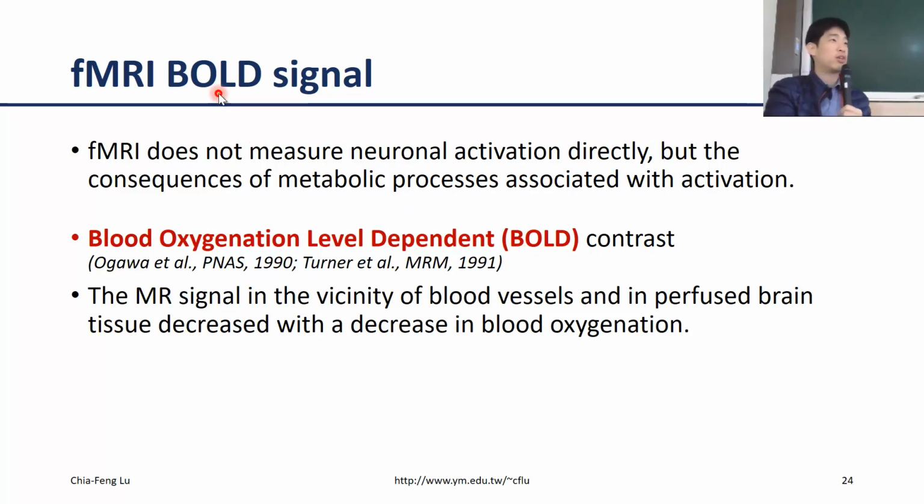But actually there is another technique we call ASL fMRI. But I think that is a relatively small number of studies using this because the SNR is pretty low in ASL and there are several limitations in ASL anyway. So in this semester we focus on BOLD fMRI, not ASL, arterial spin labeling fMRI. We are focusing on BOLD fMRI.